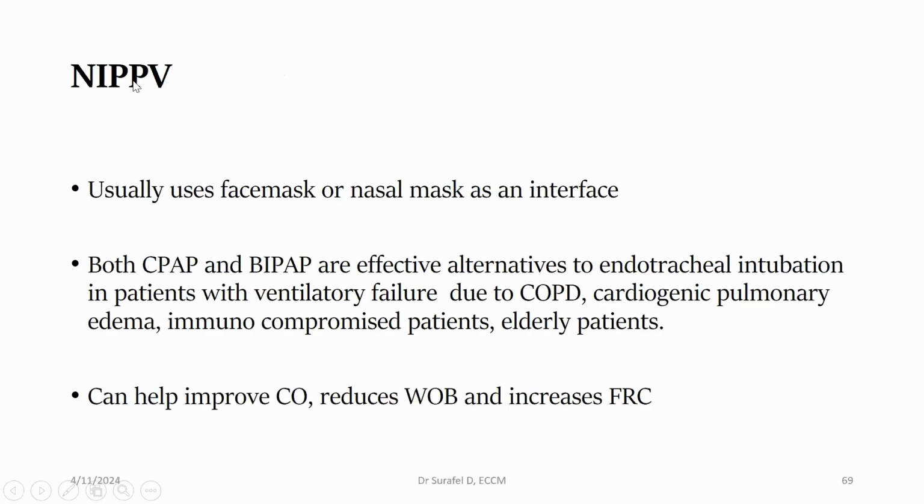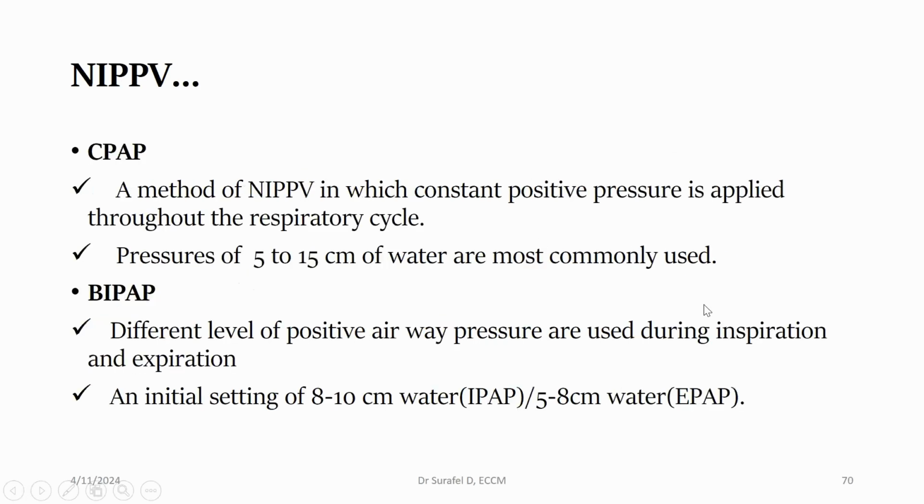So NIPPV is non-invasive positive pressure ventilation. You can use either a face mask or nasal mask. This one is not a major aim of mechanical ventilation in this particular topic. It's just non-invasive, without the use of an endotracheal tube. You can also apply positive pressure ventilation. Most of you have already been exposed to this non-invasive positive pressure ventilation, especially during the era of COVID. So most of you know about CPAP, BiPAP. I think I don't have to sweat about this anymore.